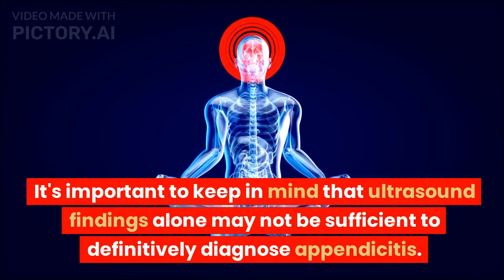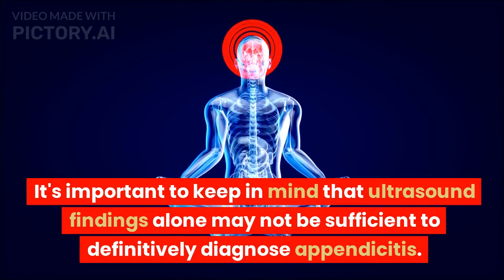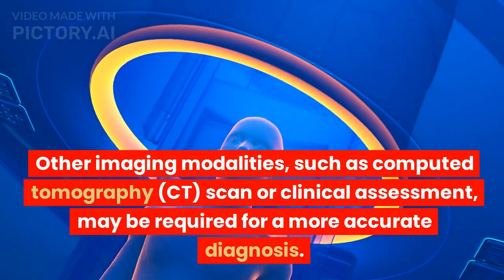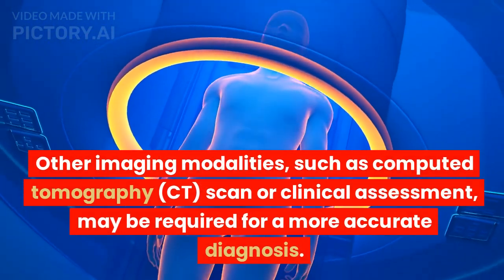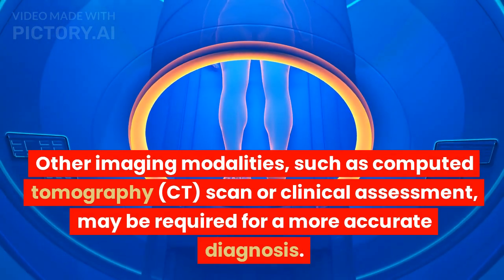It's important to keep in mind that ultrasound findings alone may not be sufficient to definitively diagnose appendicitis. Other imaging modalities, such as computed tomography, CT scan, or clinical assessment, may be required for a more accurate diagnosis.